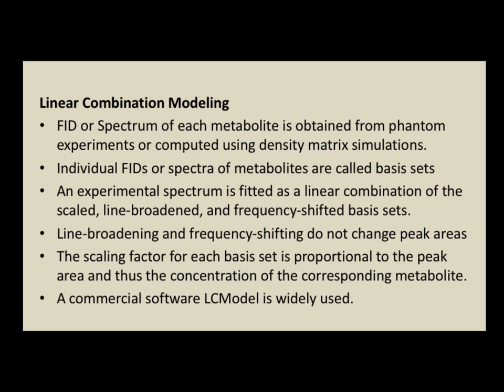A widely used technique in quantification is called linear combination modeling. For the FID, or spectrum, of each metabolite, for example, if we care about 12 metabolites, which are NAA, creatine, choline, glutamate, glutamine, GABA, we can generate a basis FID or spectrum of each metabolite using density matrix simulation or phantom experiments.